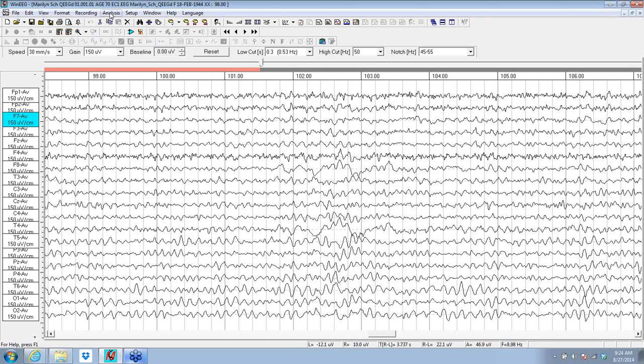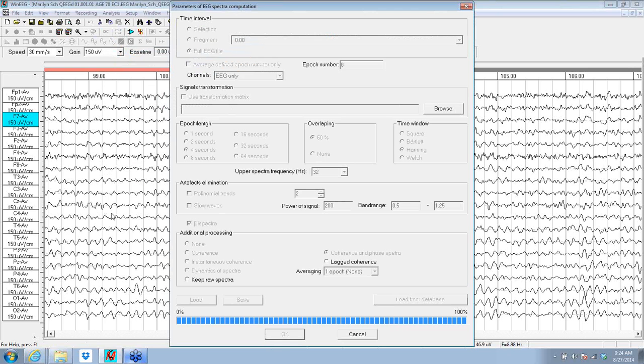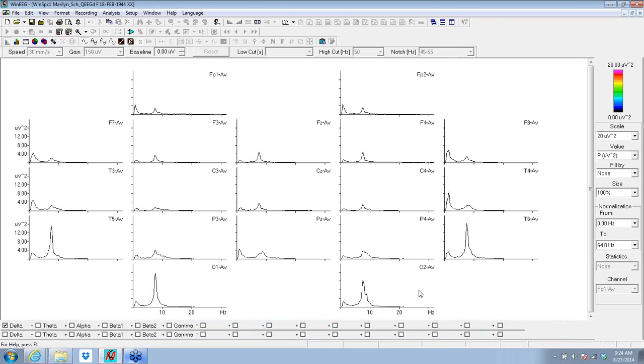We can look at the processing on this one. I'm just going to run the entire EEG. Any eye blinks or whatever's in it is going to stay in it. It's actually pretty clean. You can see the temporal features here. This is at 7.5 hertz, which for an alpha peak is too slow. The dominant peak at O2 is 7.5 hertz, which is too slow.